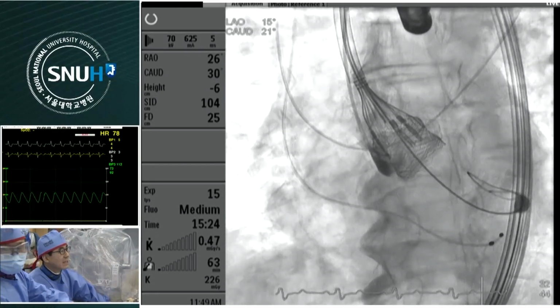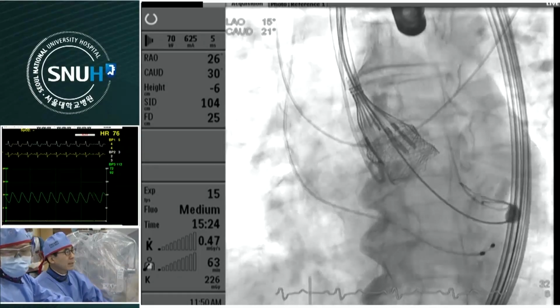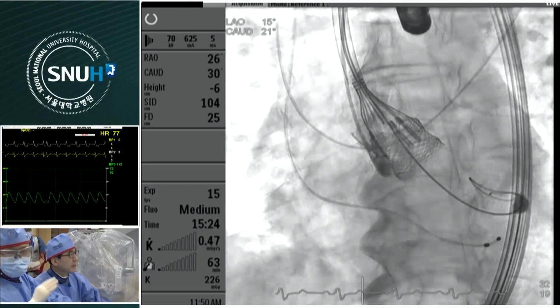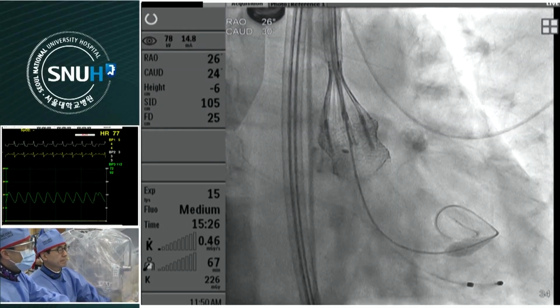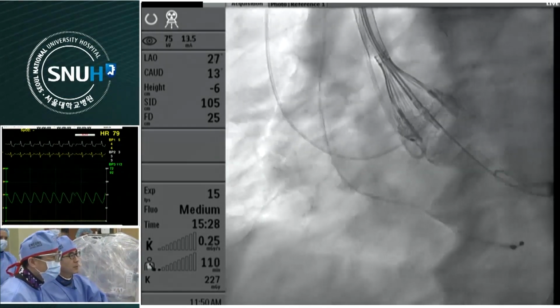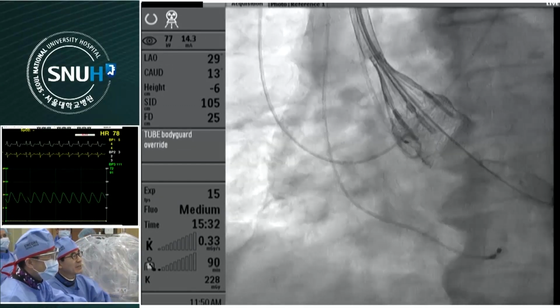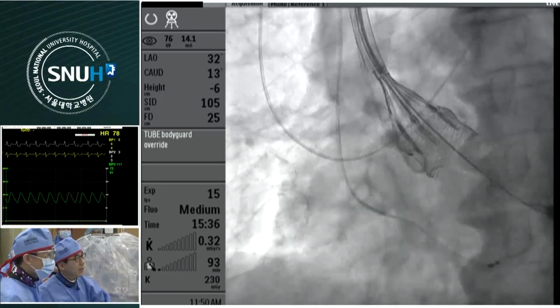Down here. We have to maximize focus on the close contact between buckle and post. This is the locking process. Can you magnify the images more? I don't like magnifying. Rotate a little more, for educational purposes. Okay, raise it a bit.